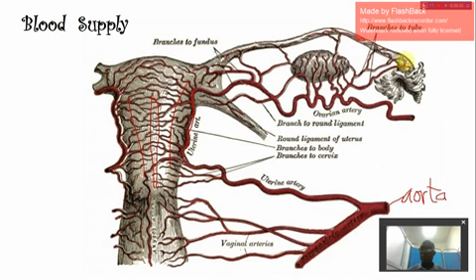As you can see, the same thing here, with branches to the tube. So the fallopian tube is also supplied with blood, and the ovarian ligament is also supplied with blood. Typically, when there's an ovarian torsion, you look at whether the blood is flowing well or not on Doppler test. When there's a torsion, there's insufficient blood flow to the ovary. This is a typical finding of an ovarian torsion. You can see this ovarian artery can supply blood to the ovary.